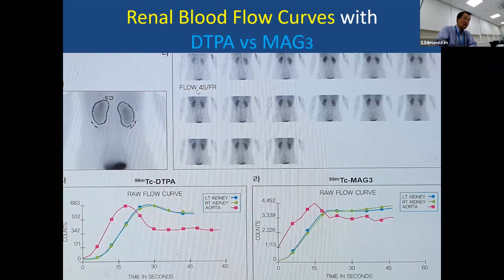So the injection has to be a bolus. There is a machine: as long as you hook it into the vein and put the radioactive material into the machine, it can inject as a bolus. Then you'll have an adequate peak.